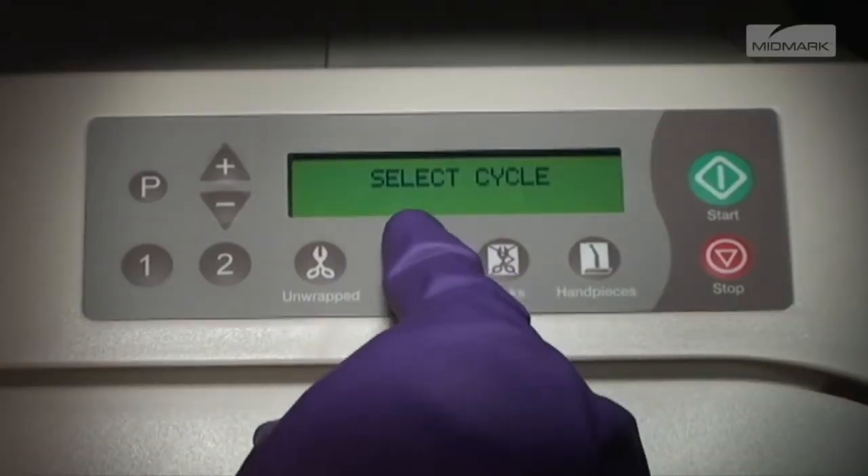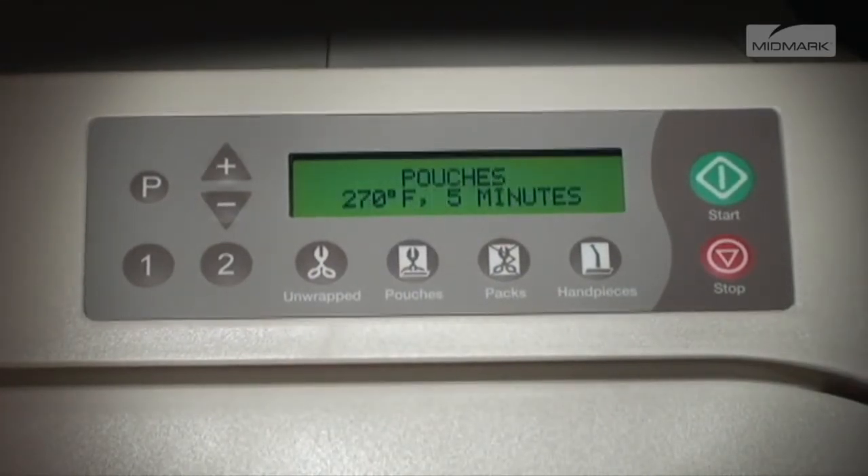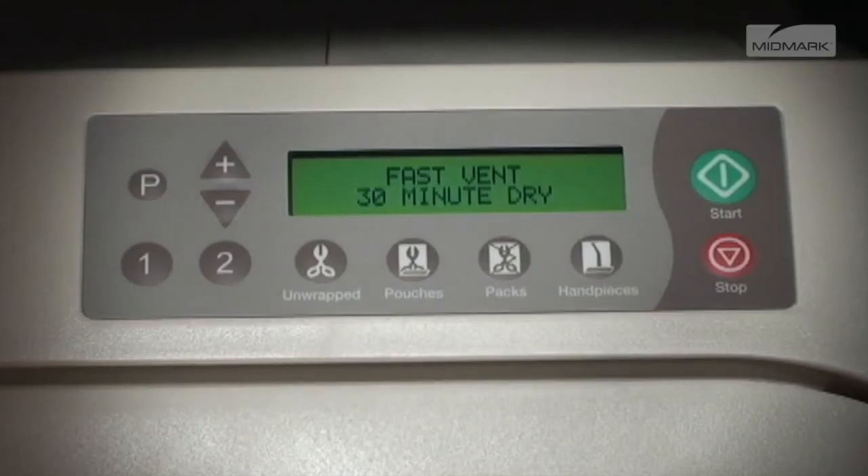After pushing one of the standard cycle program keys, the display will show two alternating screens on the LCD display. The first screen shows the name of the cycle, sterilizing temperature, and the amount of sterilizing time. After a brief pause, the second screen shows the type of venting to be used and the amount of drying time.